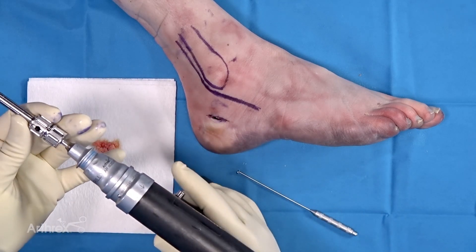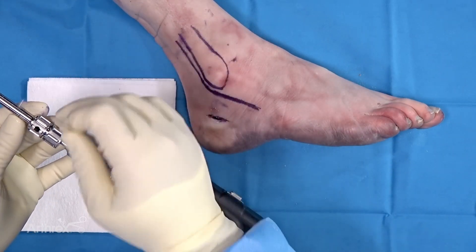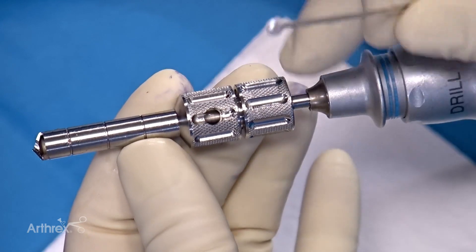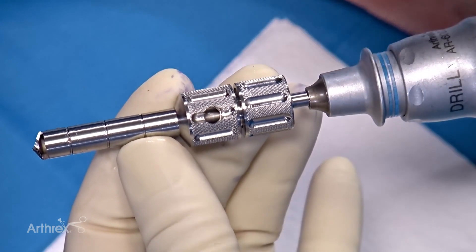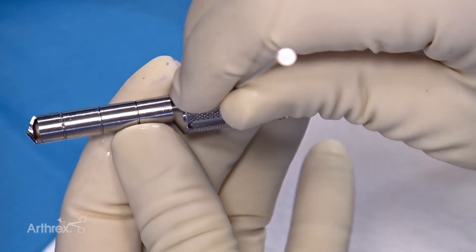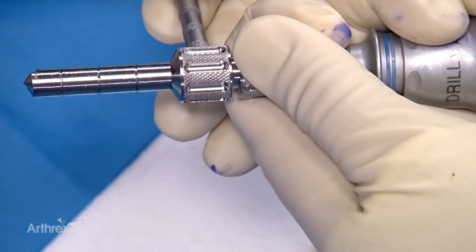Additionally, as another feature of this system, if there's hard bone and you're having a difficult time getting the harvester off of the quick connect, the plunger actually has a built-in place to insert into the harvester to help you unscrew it if needed.